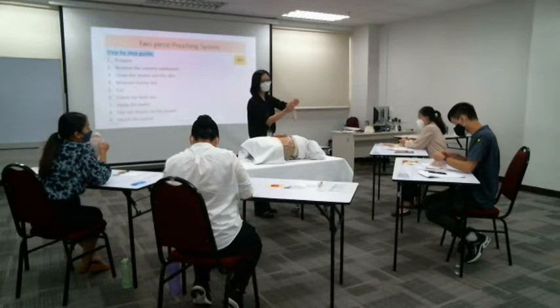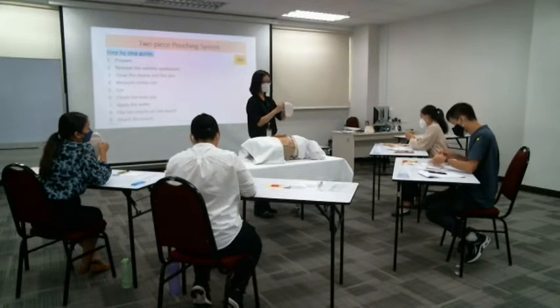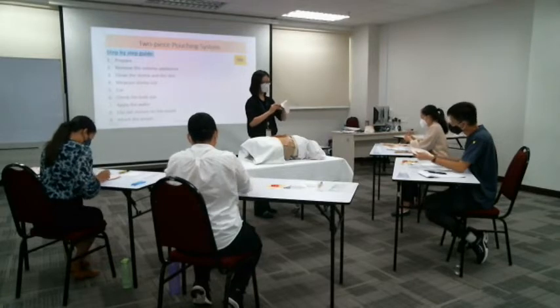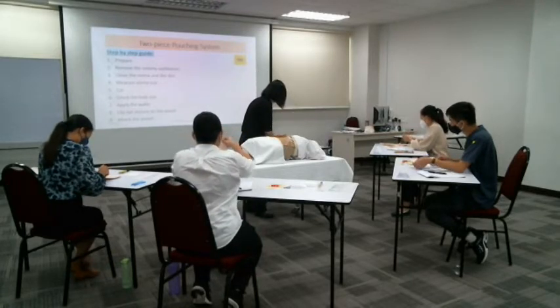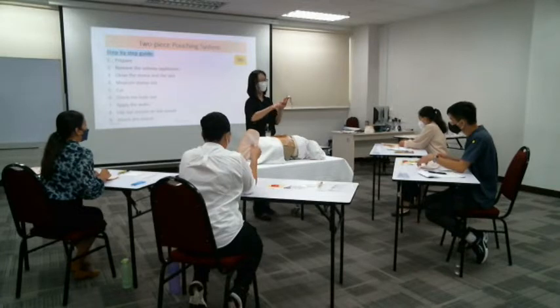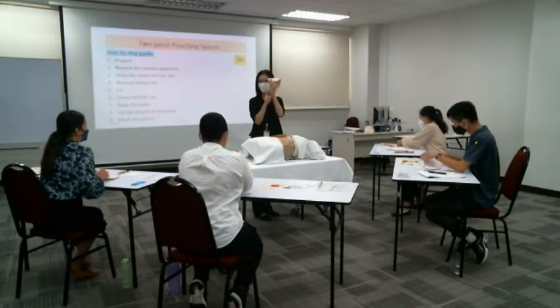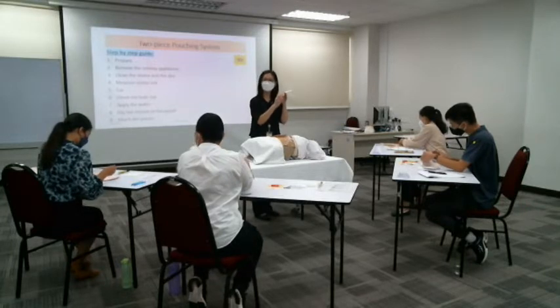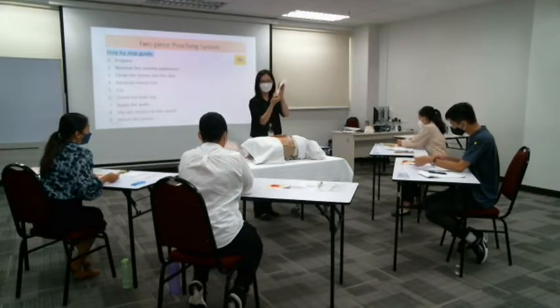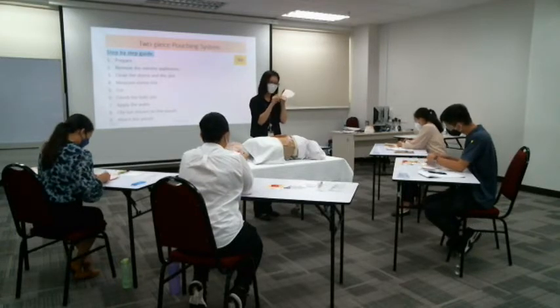Okay, only one layer. You close it. Okay. You do not require to fold two folds. Only you are to make one fold. Okay, one fold only. If you put two folds, then the clip cannot work properly. So remember, keep only one fold, and you must hear the click sound to make sure that it goes into it and locks.